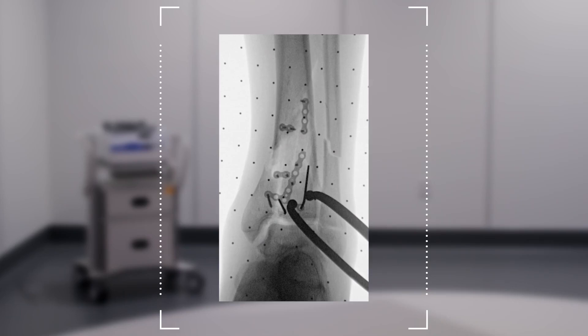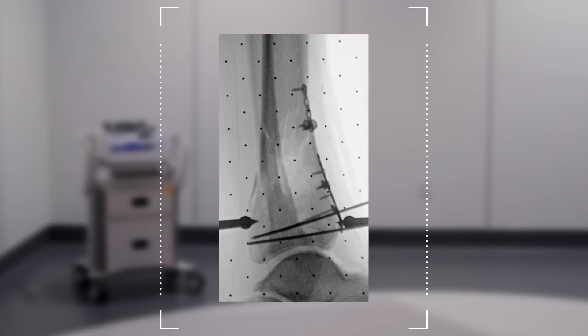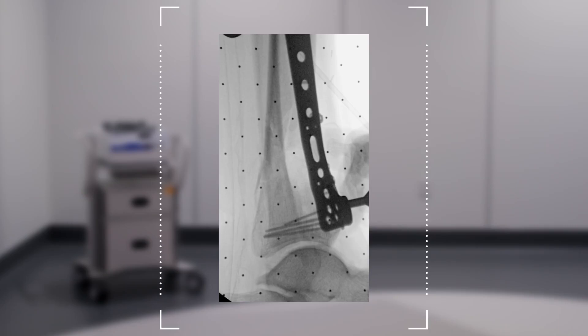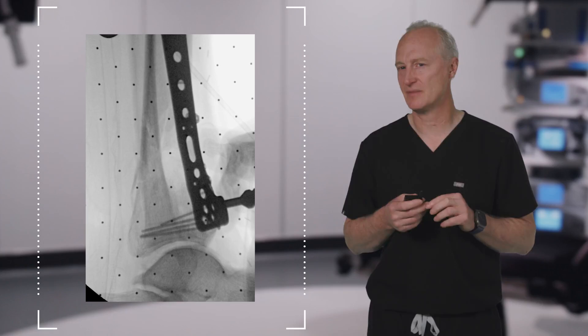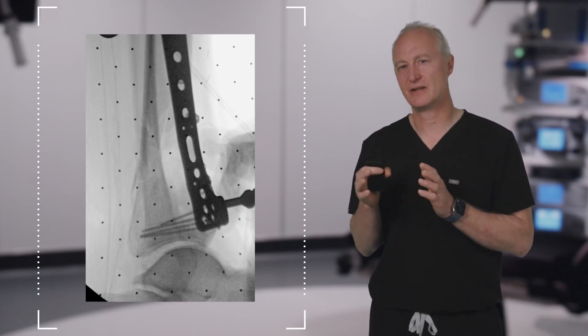Pass through this, sort of stitching the articular fragments back together, compression of the fracture plane, placement of provisional fixation in a clamp, plate applied, and for me, still a suspicious position of the talus with respect to the anatomic axis of the tibia. Talus is displaced anteriorly.